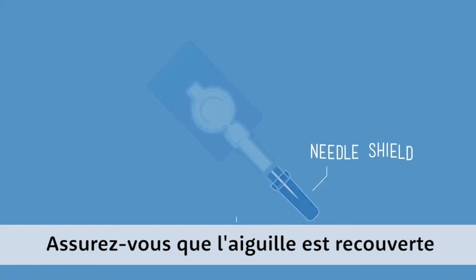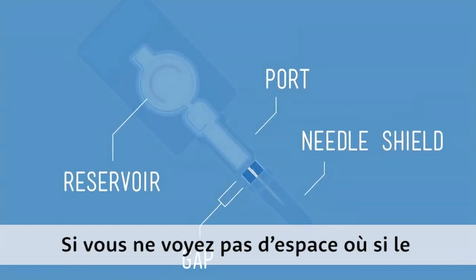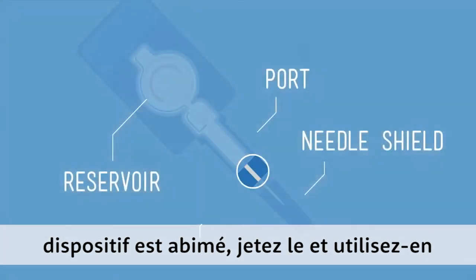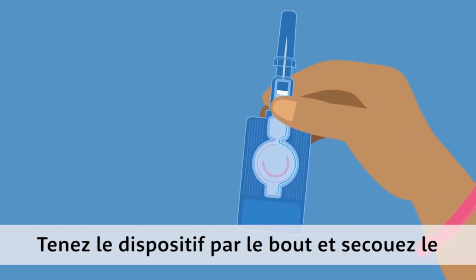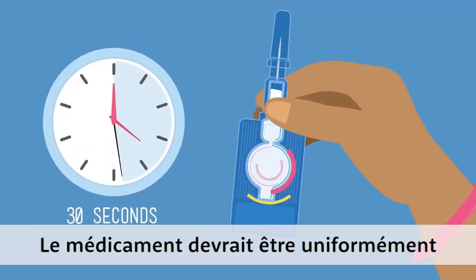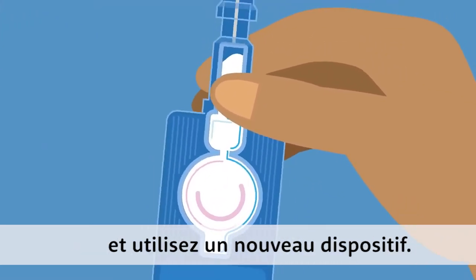Make sure the needle has a shield and there's a gap between it and the port. If you don't see the gap, or if there's damage, throw it away and use a new one. Hold the device by the port and shake it for 30 seconds to activate. The medicine should be evenly white. If not, discard it and use a new one.